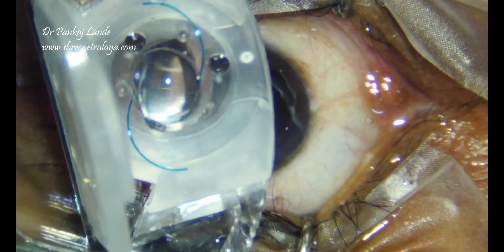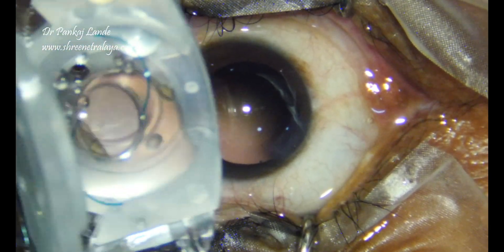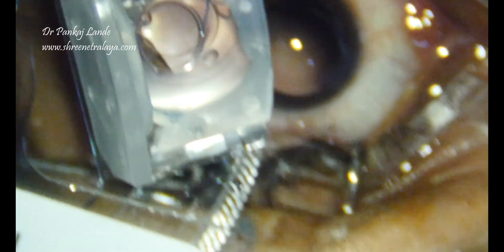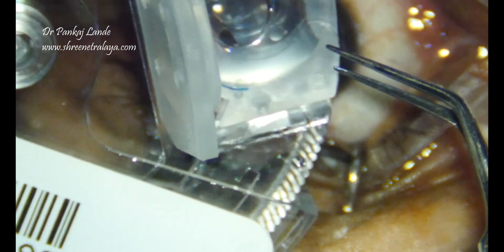Hello friends, welcome to Srinetra. I have seen many of us are not very comfortable implanting a foldable 3-piece IOL like Sensor and Alcon lenses.